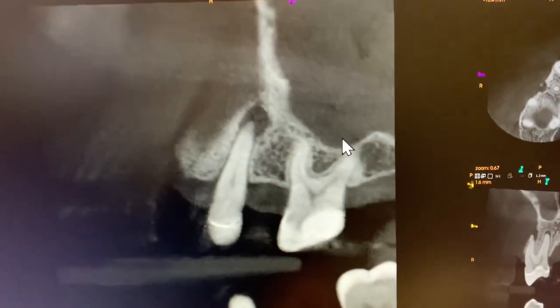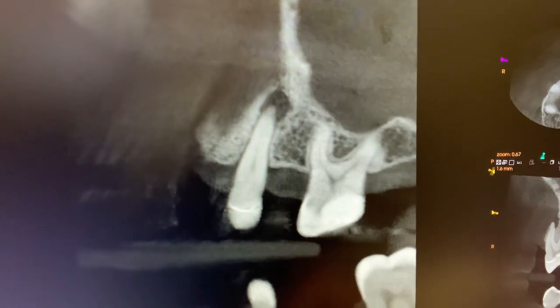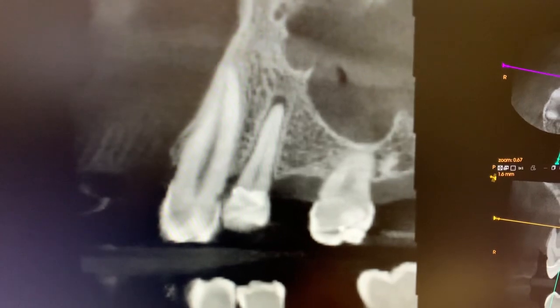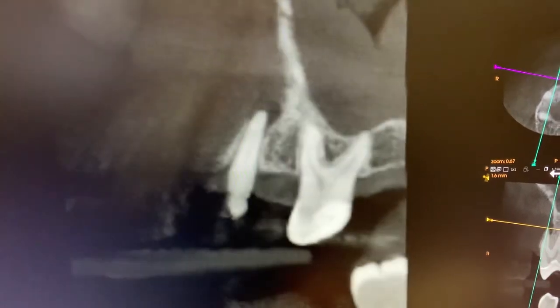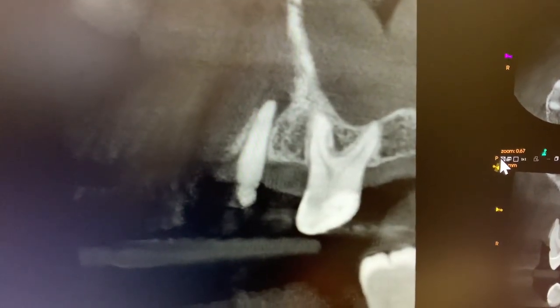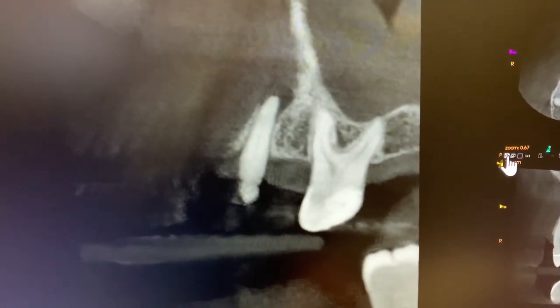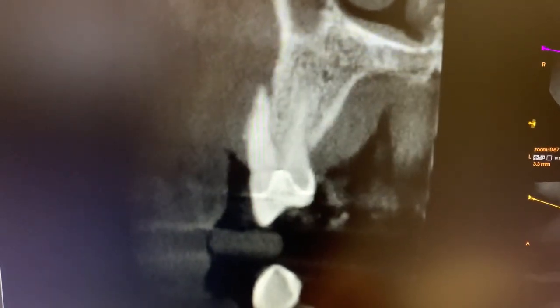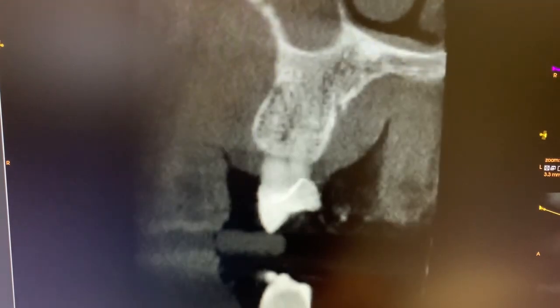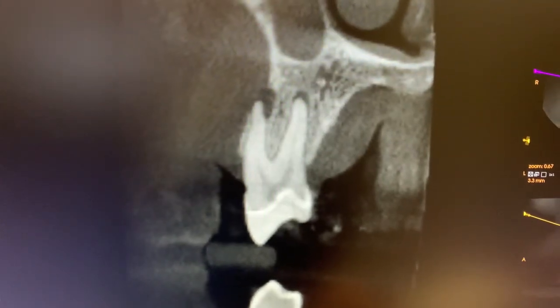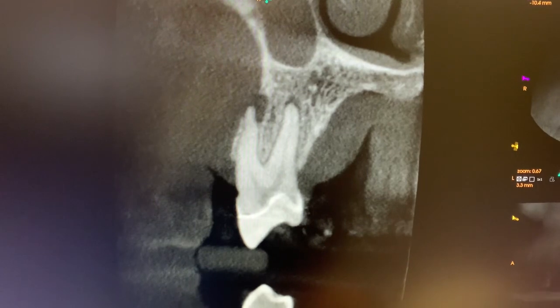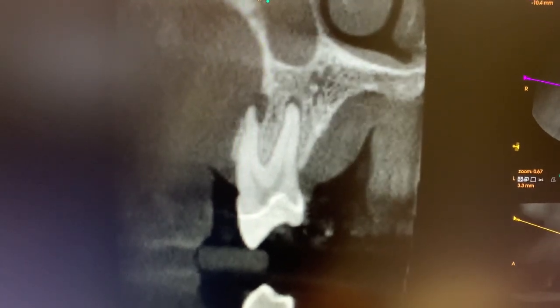If we look at it in the context of a three-dimensional scan, it becomes much more obvious as we scan through — at the tip of this root there's quite the abscess. You can also turn this 90 degrees and see that there is quite the abscess there as you scroll through those roots three-dimensionally. So they're both helpful, two-dimensional and three-dimensional x-rays, but in this case 3D really made the difference.